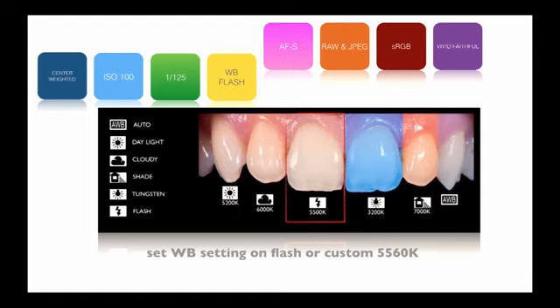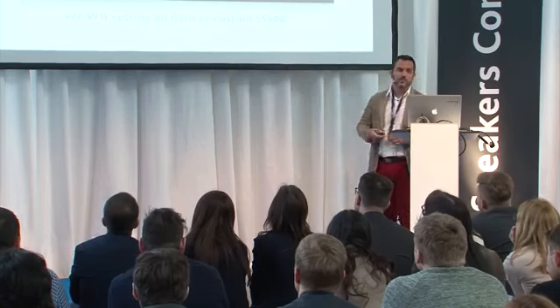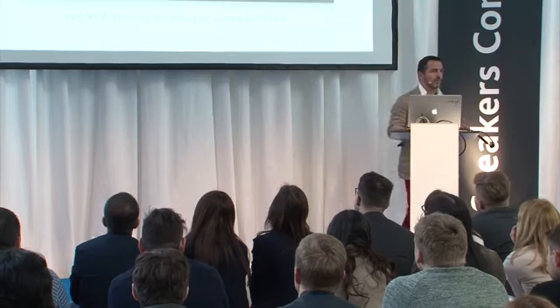If you're going to use a different white balance setting, you will have blue teeth, you will have yellow teeth, and different kinds of colors, so you don't want that. You want to have as close as possible to the natural result.